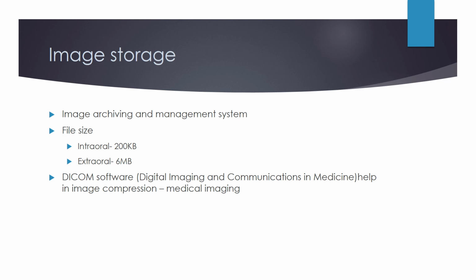When it comes to storage, you could have a backup system with a master server to store all your images if you're a very large institution with a large volume of images, or you could have separate storage built into your computer itself and a separate backup also, because you wouldn't want to lose any of your patient images. Software that is common to all digital images is called DICOM, which is digital imaging and communications in medicine, that helps in image compression and is prominently used in medical imaging.